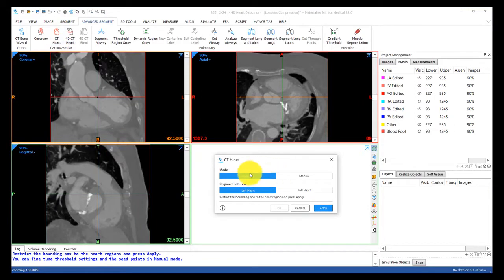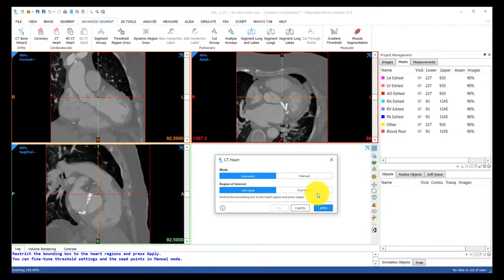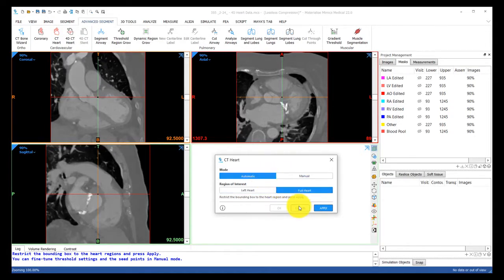You can see this tool offers an automatic method as well as a manual method, and it gives you the choice to segment the left heart or the full heart. Let's go ahead and segment the full heart using the automatic method.